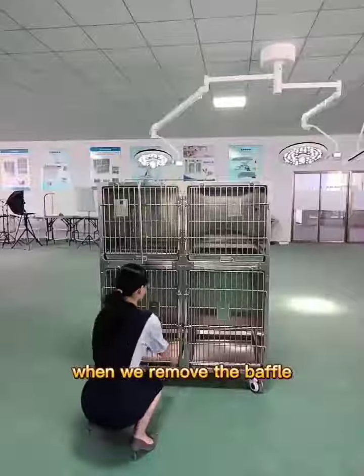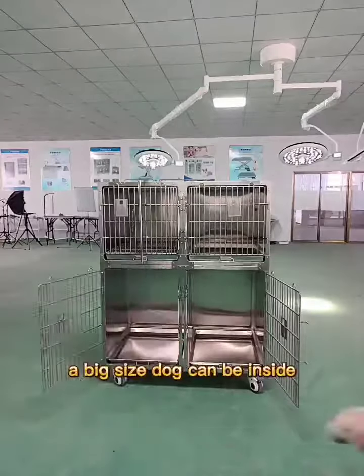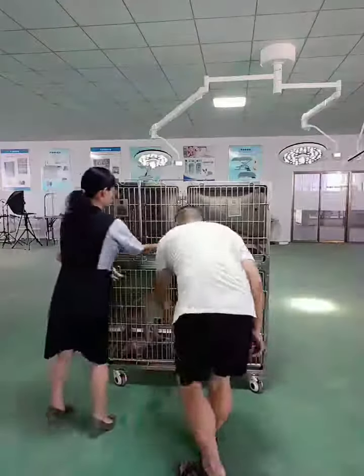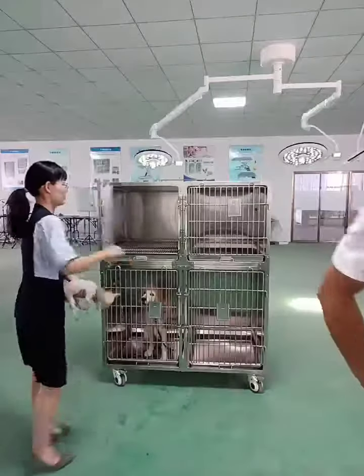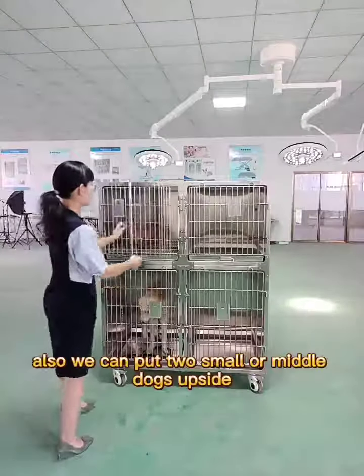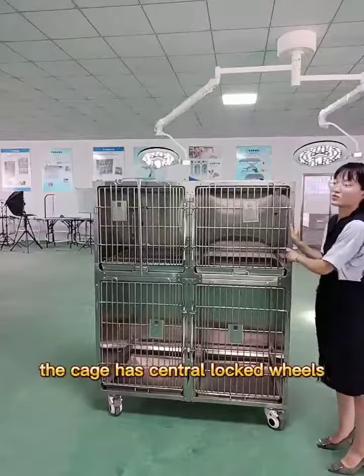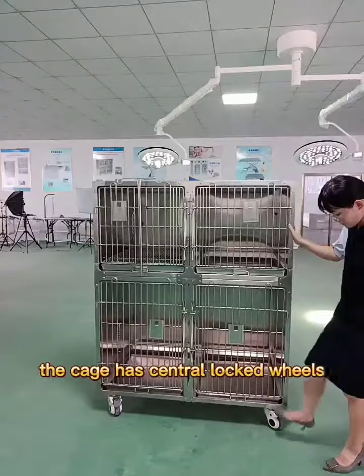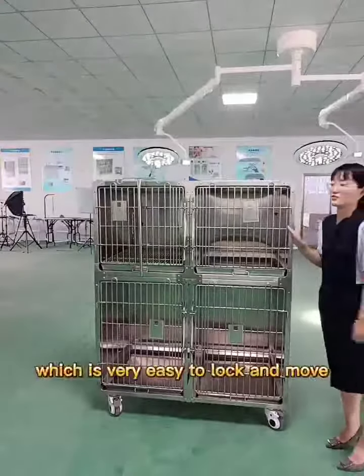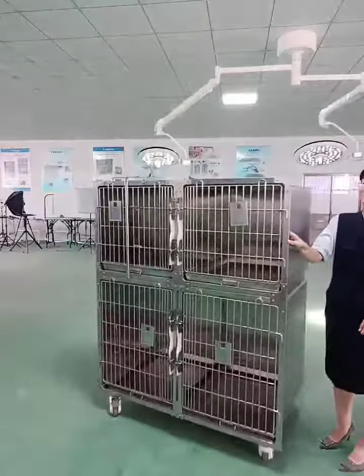When we remove the baffle, a big size door can be inside. Also, we can put 2 small or middle dogs upside. The cage has central locked wheels, which is very easy to lock and move.